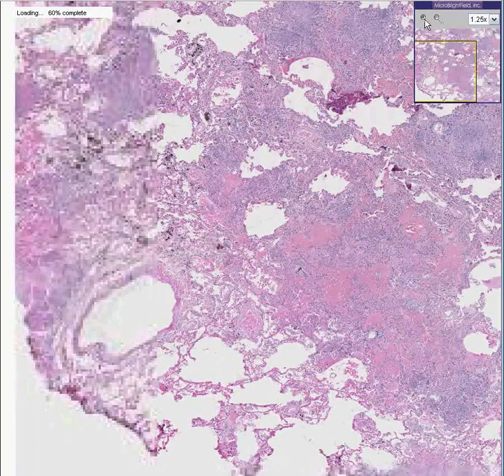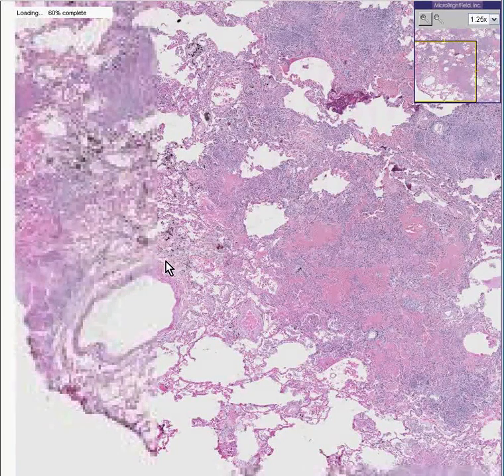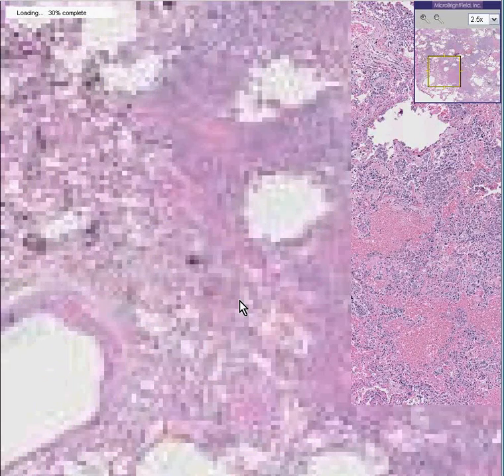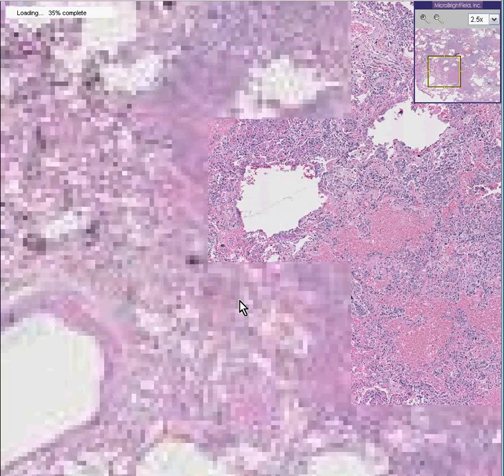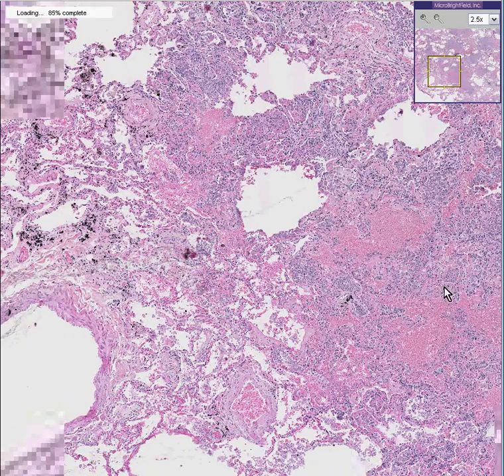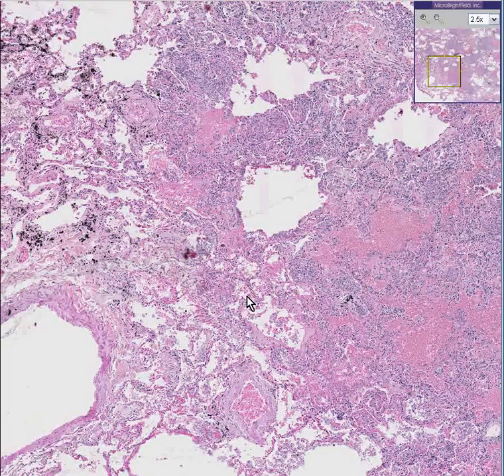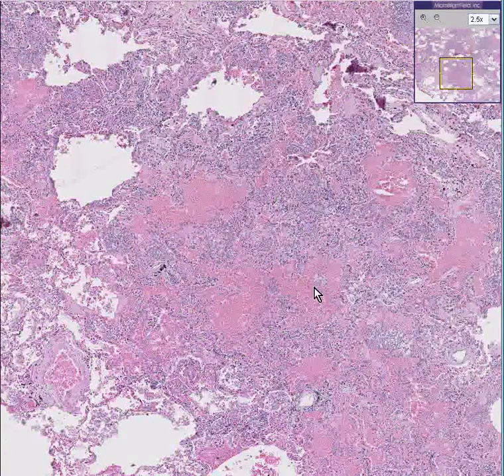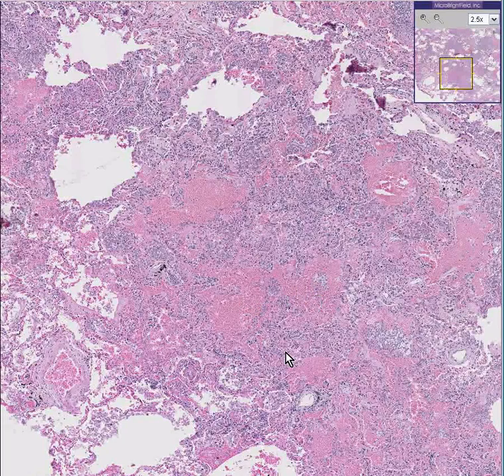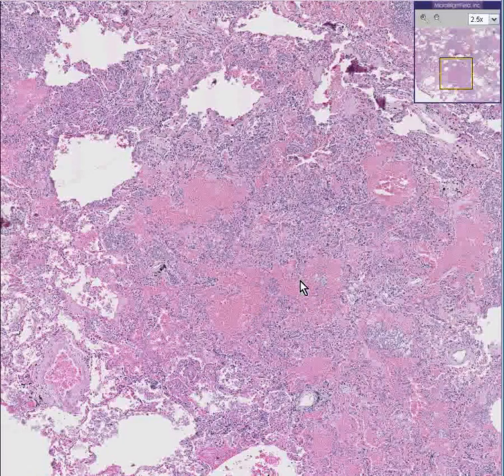We can see that the lung is about 70 or 80 percent replaced, in which the alveolar architecture is destroyed by these areas over here, which you can describe as having a lot of either hemorrhage or necrosis, and having a lot of inflammatory cells.